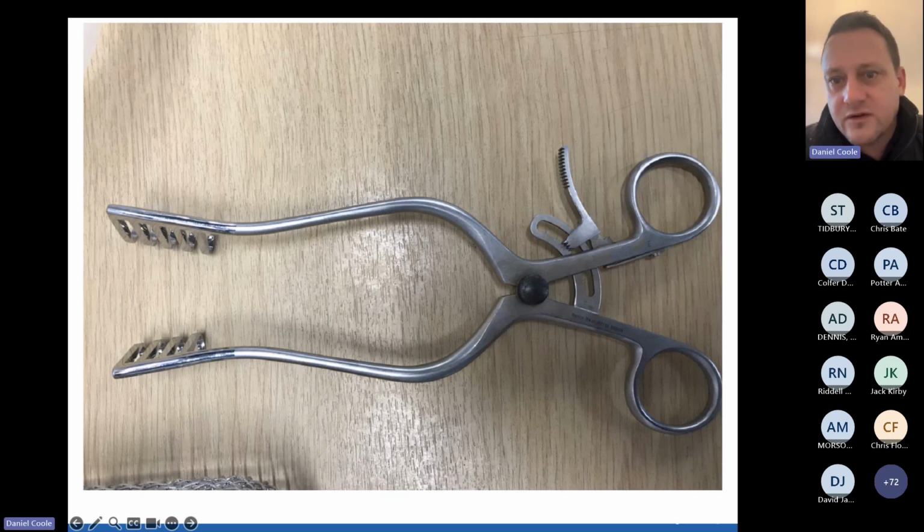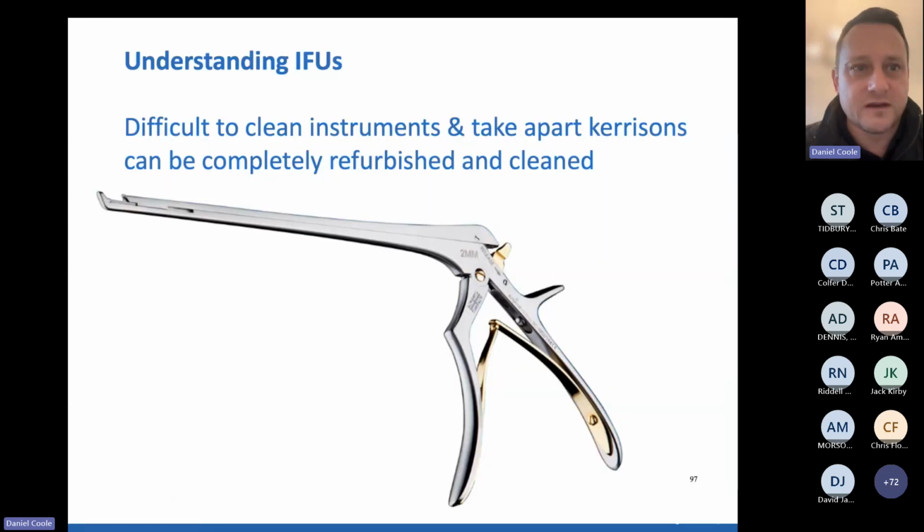I've got an example here of a mild steel nut being used. So here we have, I guess, a repair that's been done, or it might be a device that's been manufactured. The rest of it has been manufactured from the correct 420 stainless. This, and then unfortunately this is mild steel, so this has gone rusty because it's not to your ISO 7153.